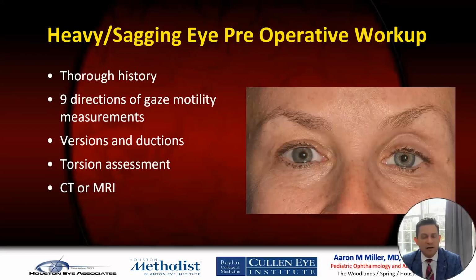Sometimes the MRI, I have to admit, when this was first being done, I did a lot of imaging. I do CTs or MRI scans. I do what I would call a quasi-coronal protocol, and had to teach my radiology colleagues what I'm looking for, and separately identifying the right and left eye orbit with this protocol. So you try to get more of a direct view on the axis of the optic nerve going posterior, as opposed to the typical coronal images, which are crossed at an oblique angle on the globes themselves. That's how you can get more assessment.